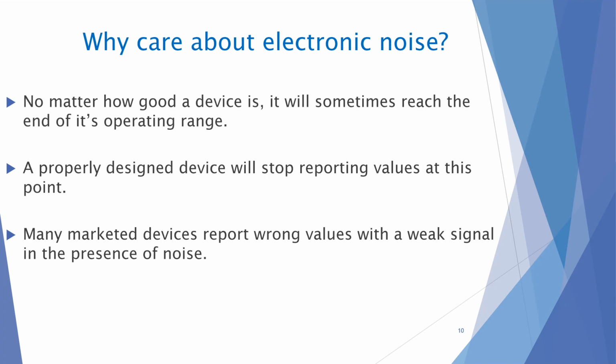And what that really is, in some cases, or I'll say maybe, because I'm a technologist and I don't think about the physiology, I don't understand the other underlying effects, but I say, well, you could explain that rather than a racial thing or a skin color thing, it's just data being colored by the algorithm in the instrument.